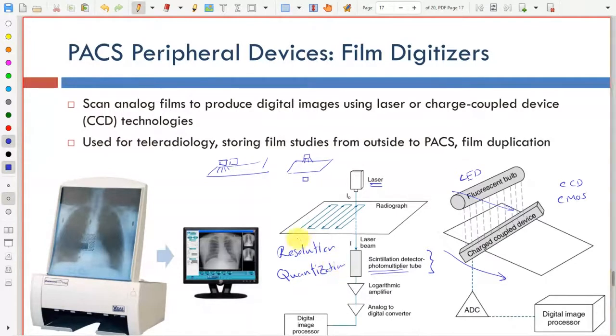The difference between these two is that for the resolution, for example, I say I'm going to take an image that is 5K by 5K. This is the resolution. For the quantization, I say that I have, for example, 32 bits per pixel. So each one of the pixels in the image, I can have in 32 bits of information. So it's very deep, and the dynamic range here is very high. Usually this is not required. Usually 16 bits should be enough, but you can go as high as you want.